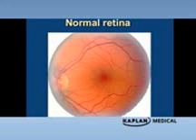The external surfaces of the blood vessels you see are smooth and even. There are no aneurysms bulging off of them. Aneurysms block the perception of light. There are no hemorrhages in the vitreous. Hemorrhages in the vitreous are like eclipses where your moon goes near the sun and blocks out the light as it shines upon the earth.